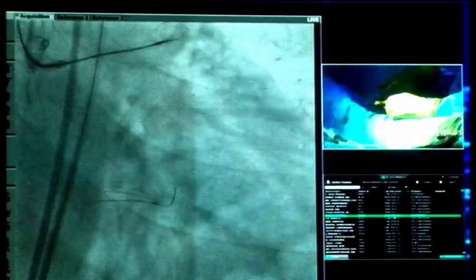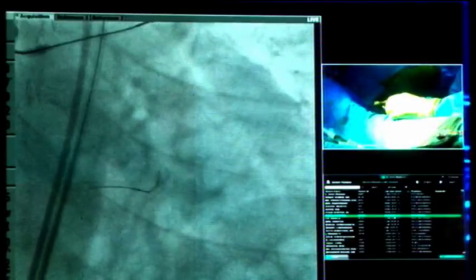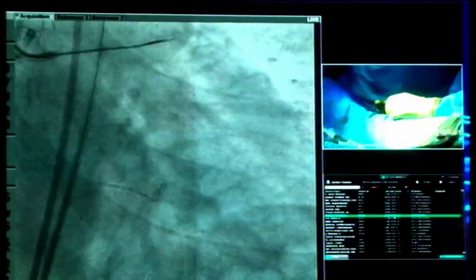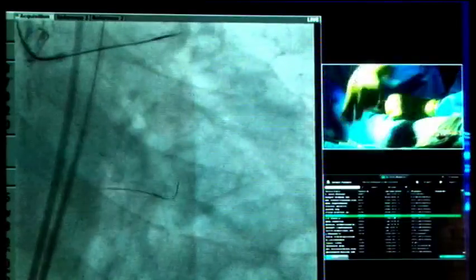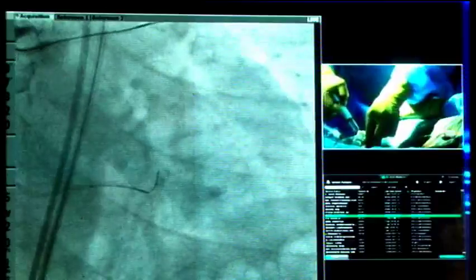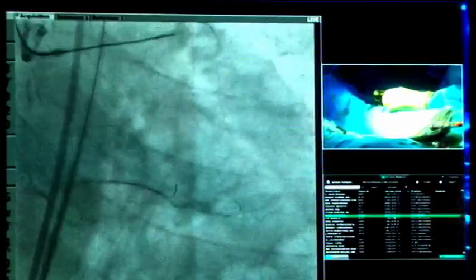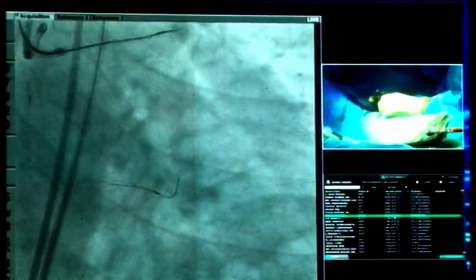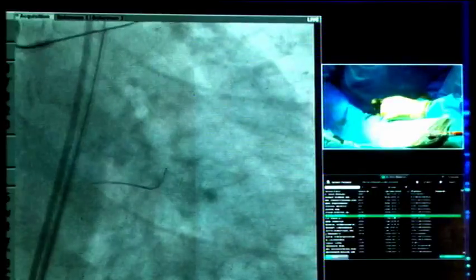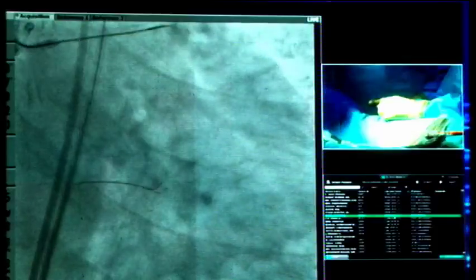This is what I was telling. You are trying to say, you wanted to go proximal, this or this one? Test for the right side injection. Yeah, right side injection, please. Injecting right. I think this is one of the, but the angulation is a little bit steep, I guess. That's why it's not giving support. It's bending. Yeah, it's bending at the junction.